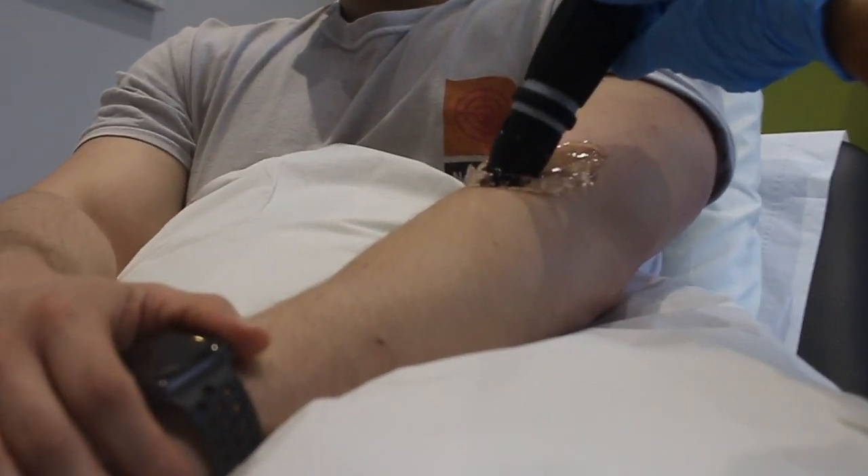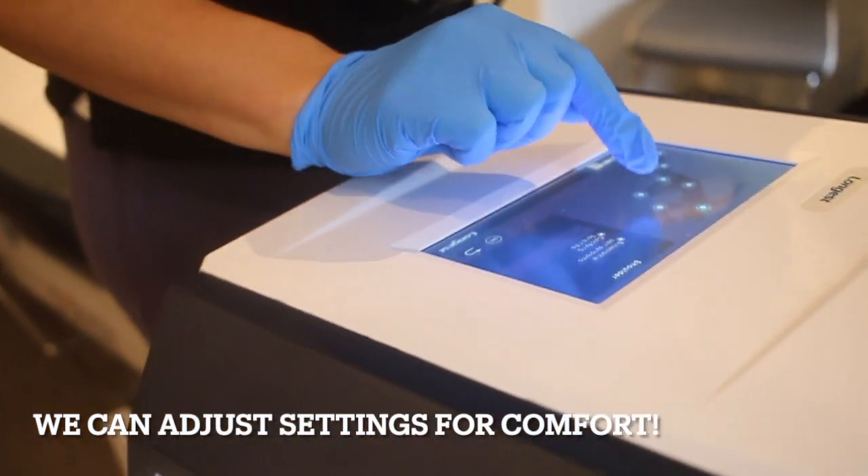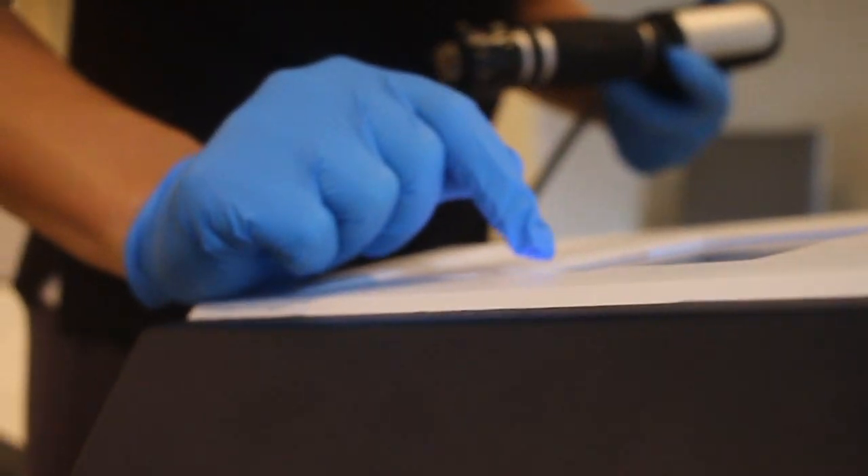Going back to whether it hurts — I'm going to be honest, it can be uncomfortable, but very minor. And if you have any problems, you can let the physio know and we will adjust the settings to make it more comfortable.